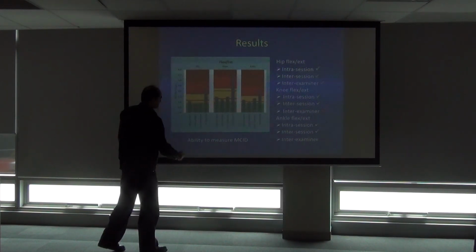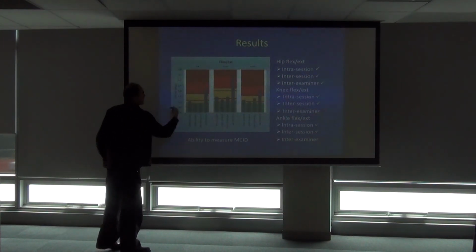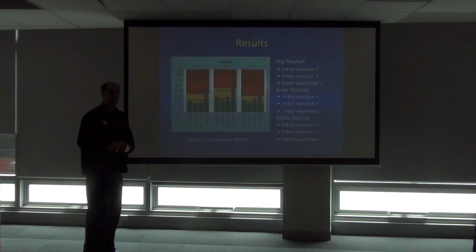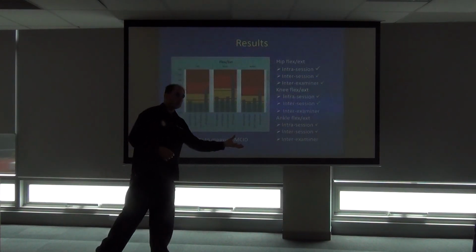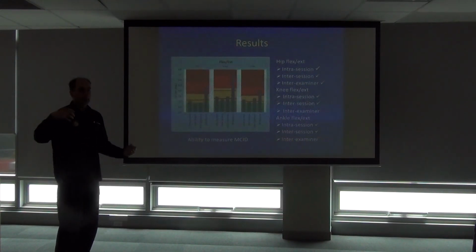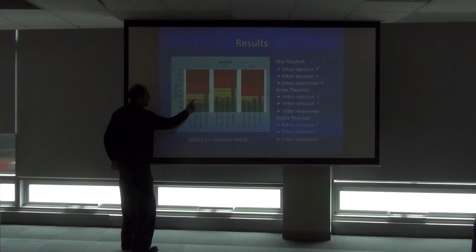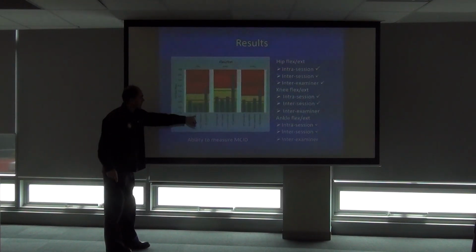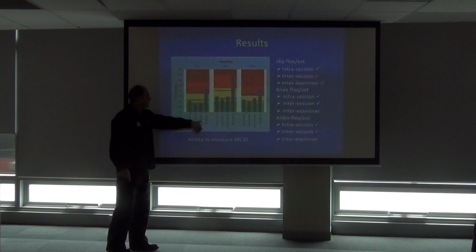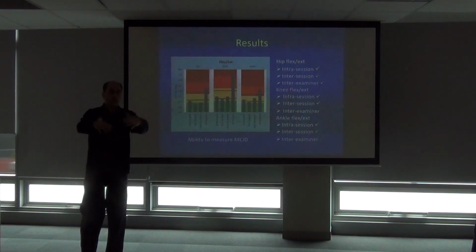For the inter-session, you're looking at the minimum clinically important difference based on the standard deviation, because typically we have one session, they go away, come back some days later, and you do another session. You know, single value. So we're more interested in this being below this value for the inter-session. Then there's the inter-examiner as well. And then this one is the total variability.